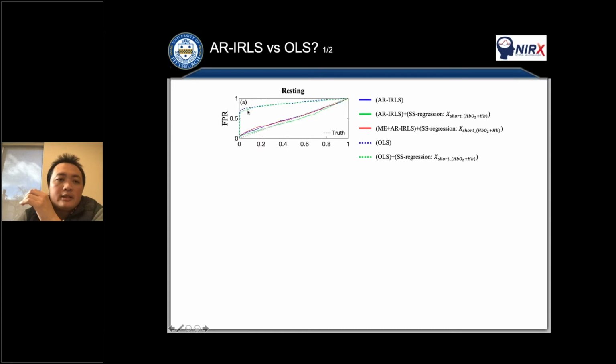OLS, you can see this one has a high positive rate, right? It means when you have a p-value of 0.05, OLS reports about 0.7, or 0.64. So it's a high false positive rate, right?